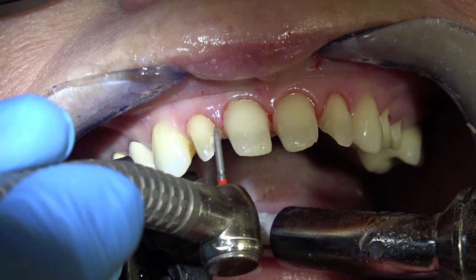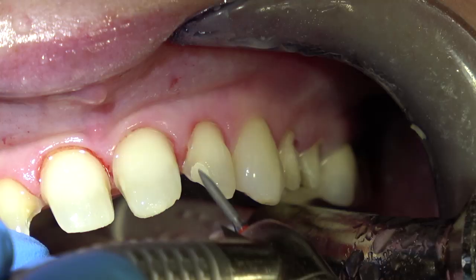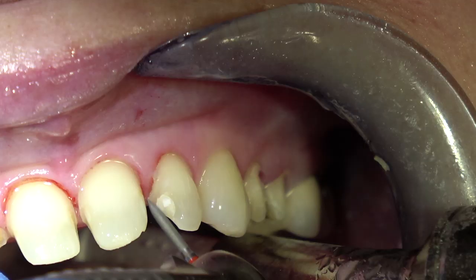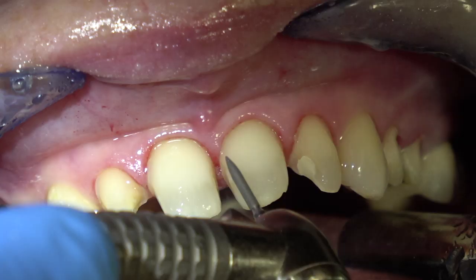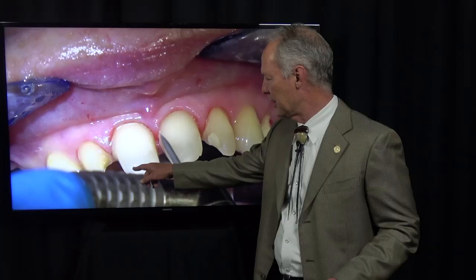Now what I'm doing here, these had composite restorations on the teeth, and so I'm just polishing them just a little bit to be sure that the adhesive is completely off of those restorations, because it'll stick to them. Now if I had decay here, see, this restoration has come off. So I'm going to show you what I do in that situation.